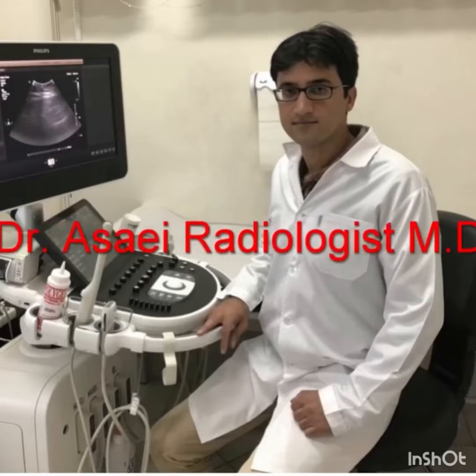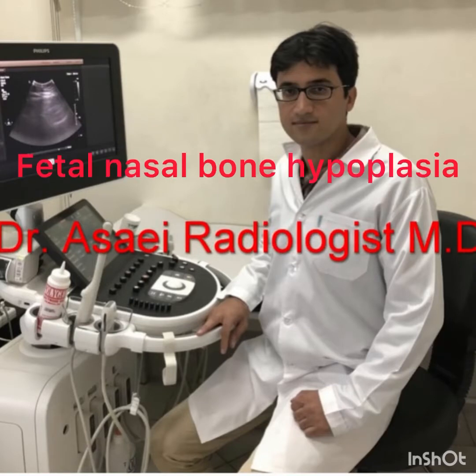I'm Dr. Asai here with a new sonography discussion on fetal nasal bone hypoplasia.